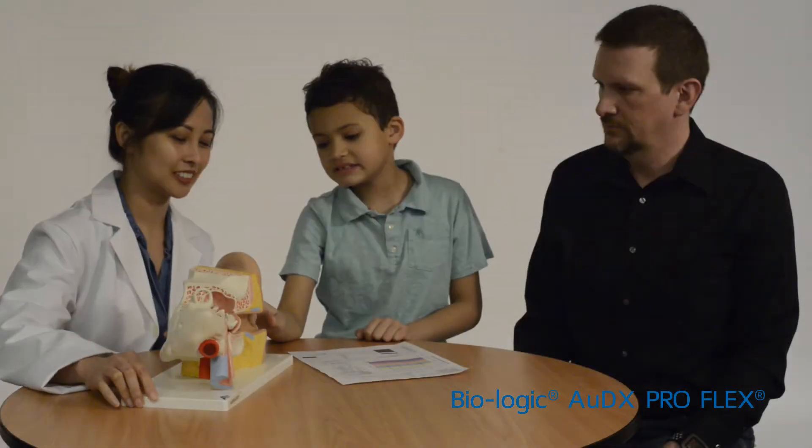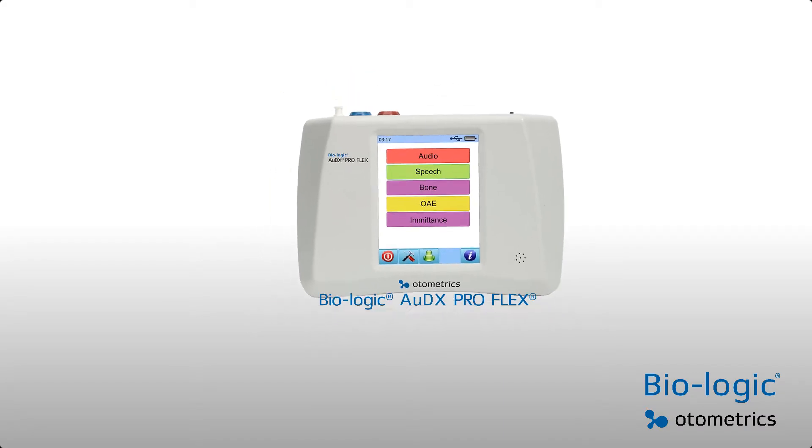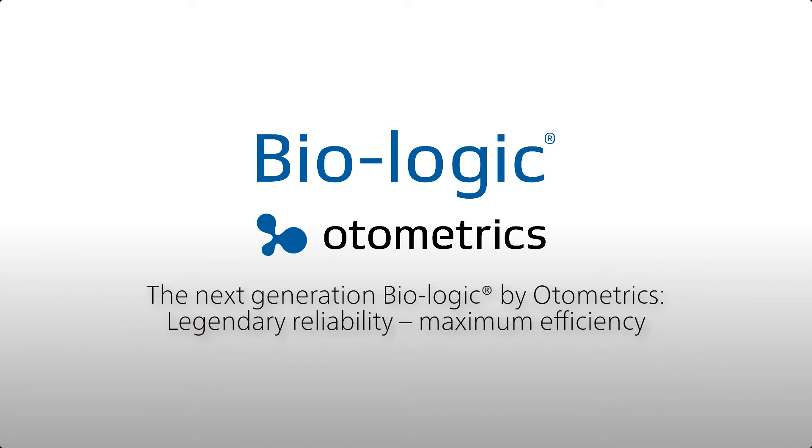All-in-one testing means that you can take the full diagnostic test battery directly to your patient. Customize your Biologic Audix Pro Flex today — talk to your local Otometrix partner and be the first to experience the next-generation Biologic.